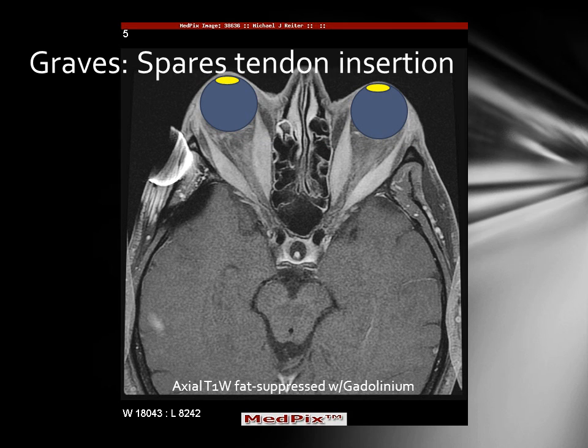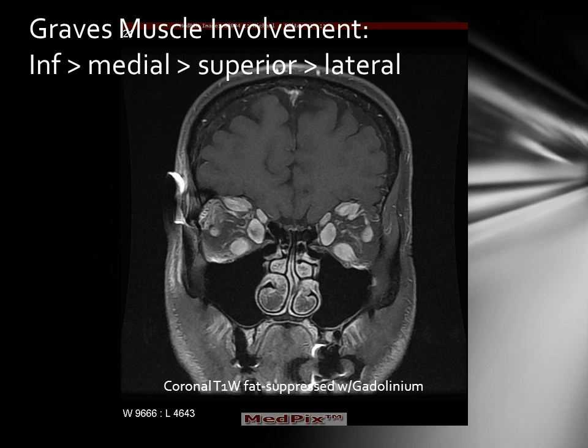We can also identify that even though the enhancing extraocular muscles demonstrate enlargement, there is sparing of the tendinous insertion of the muscle on the eyeball. This is characteristic of Graves' disease and may be a differential feature in distinguishing this process from orbital pseudotumor.